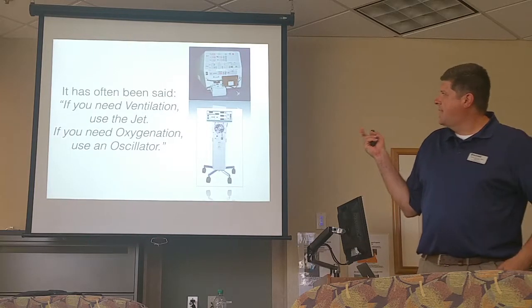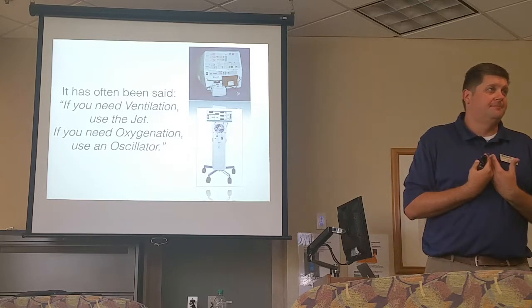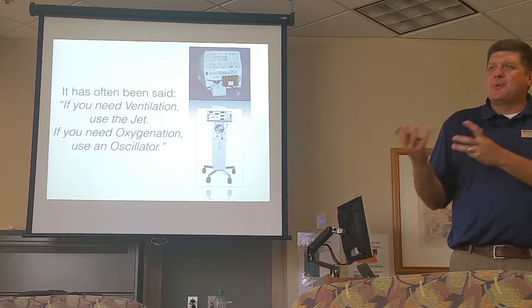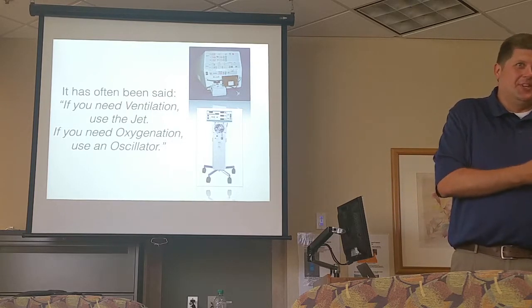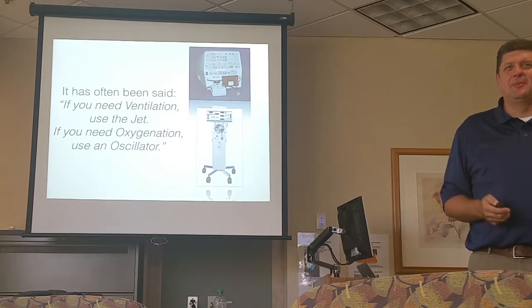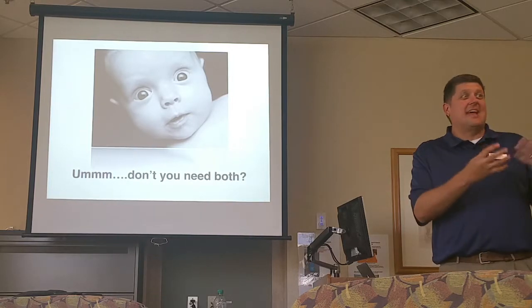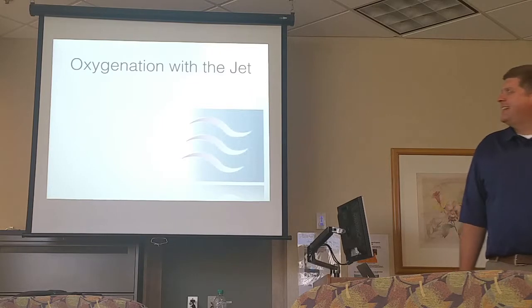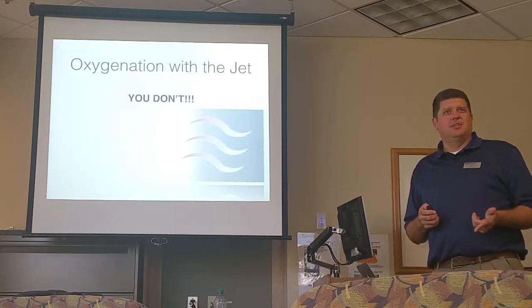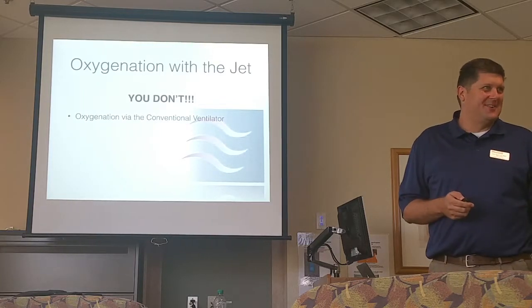So this is a common phrase that I hear quite a bit, and many years ago I believed it too: if you need oxygenation, go with an oscillator; if you need ventilation, go with the jet. The jet's a really great ventilator, and the oscillator is a great oxygenator. Well, it's true, but don't you need both, right? I mean, one may be worse than the other, but I'd like to have both, if that's okay. And the thing about oxygenating with the jet is that you don't oxygenate with the jet. You oxygenate with the conventional ventilator that's with the jet, okay?